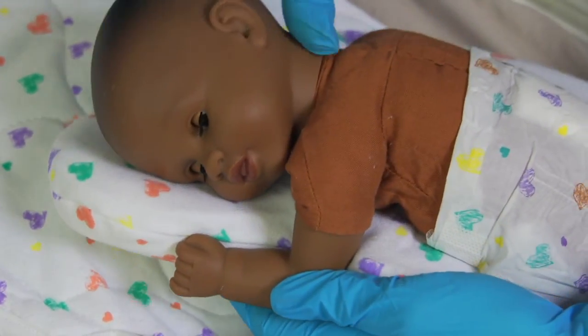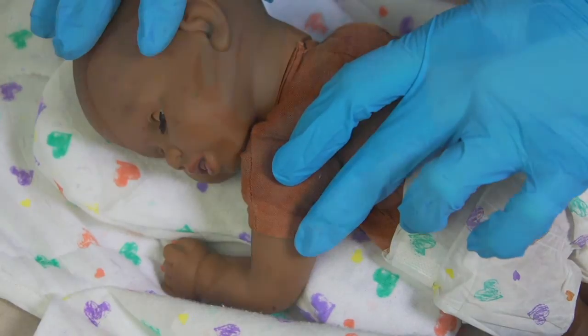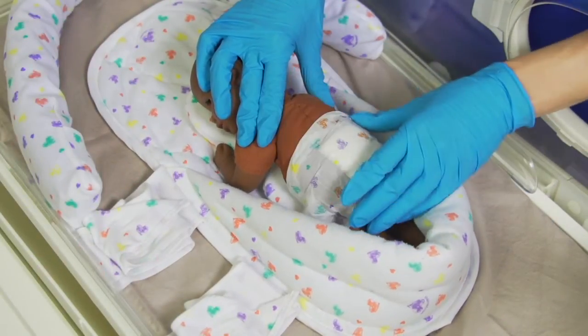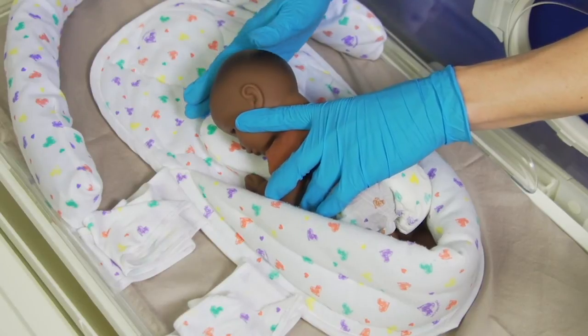Hold and slowly rotate the infant to a prone midline position. Ensure that the hands are toward the mouth for self-soothing. Be sure the hips are rounded and the feet are placed in the Snuggle Up. The infant should be supported from the top of the head to the navel. The hips should be flexed.